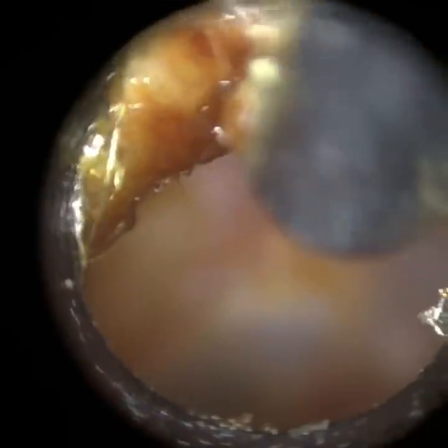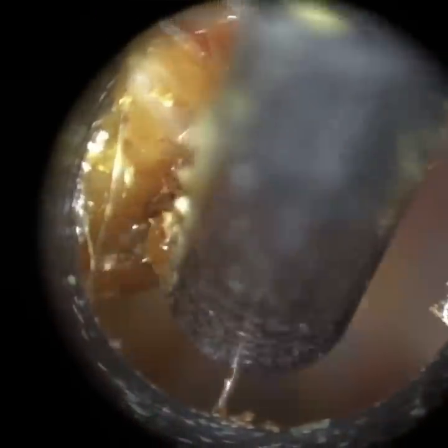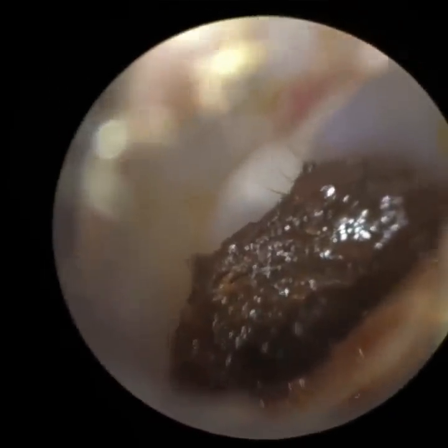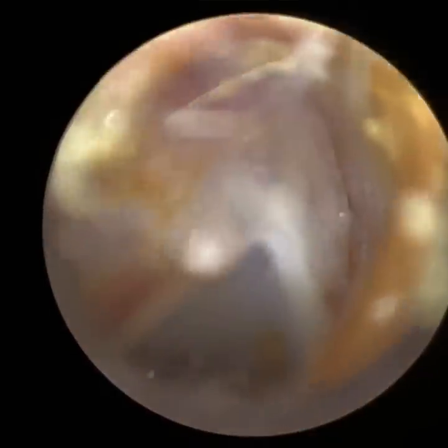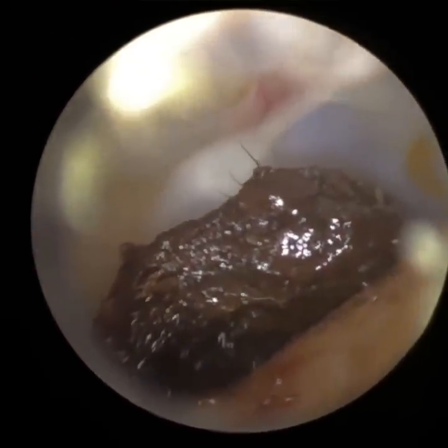This is right near the entrance — just past the first bend, before the second bend. Just on the roof there's a bit of dead skin, some soft wax. There is still some residual wax deep in there — you're going to see that in a moment, right up against the eardrum. And this is where I think the WaxCope is going to come into its own. Just adjusted the focus there. With the endoscope, the view's unparalleled.